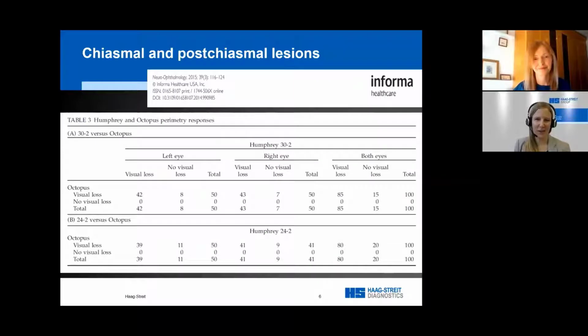So let's start looking at the chiasmal and post-chiasmal lesions that you talked about before and the benefits of kinetic testing. Can you explain more in detail what the benefits are, how you test there? Well, first of all, I think an awareness of how visual field loss develops is helpful for these types of lesions. In chiasmal lesions, we see the majority of our cases anyway having pituitary adenoma more than other tumors or neurological conditions affecting that particular area. Pituitary adenomas first compress the inferior part of the optic chiasm, and that corresponds to our superior field of vision.